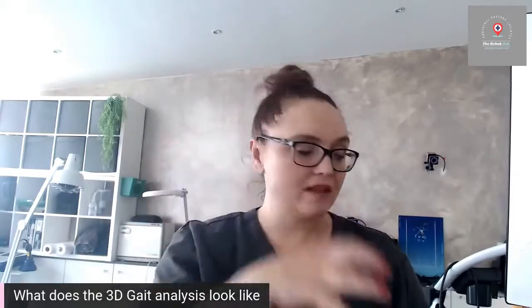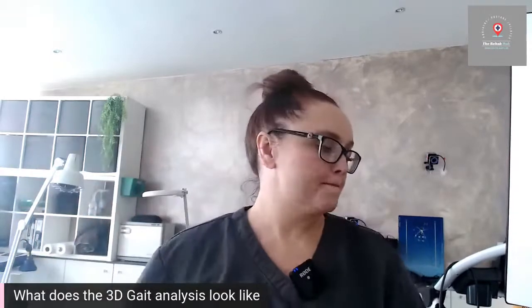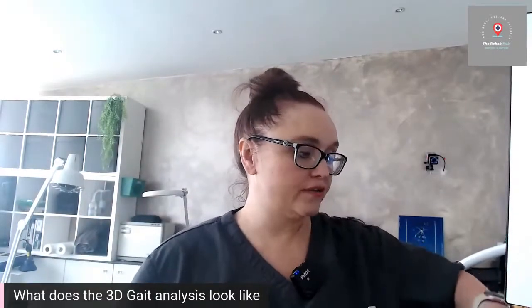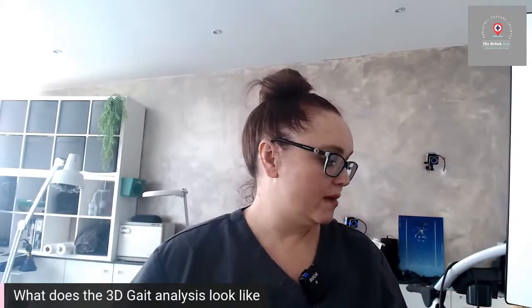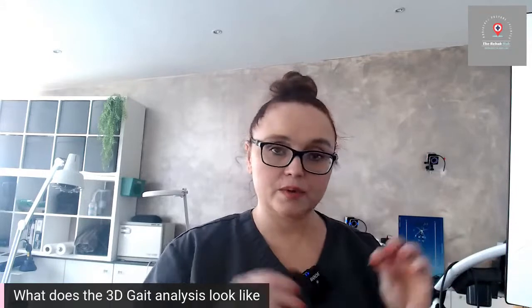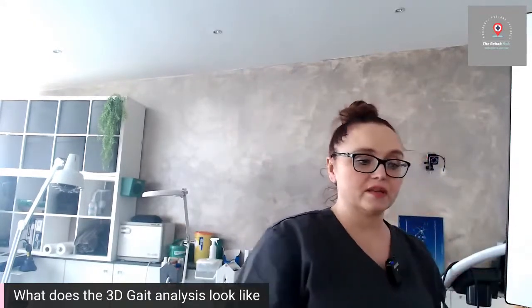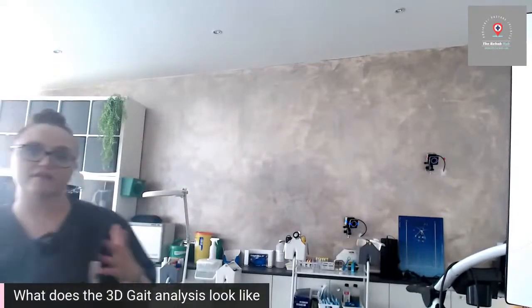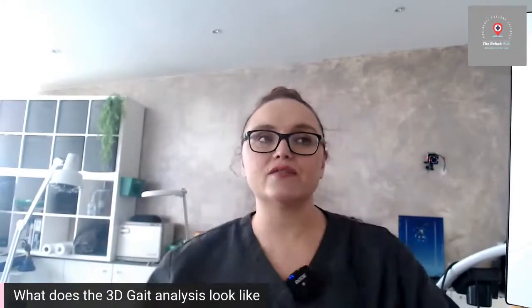So by gathering that data, it helps us rule out and then work out what to do about it. We also measure how flexible you are. So yep, we literally put measurements on it. We will measure your leg length discrepancy. We have all our tape measures and stuff. We will measure your strength. We'll measure your flexibility. We will measure your range of motion. So we don't just guess that, oh yeah, that feels okay. We literally put a number on it.